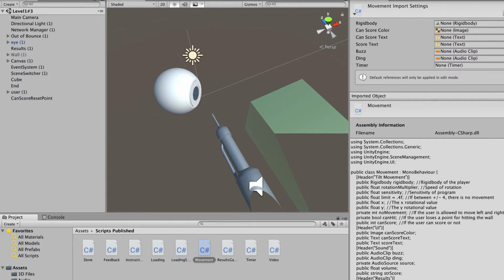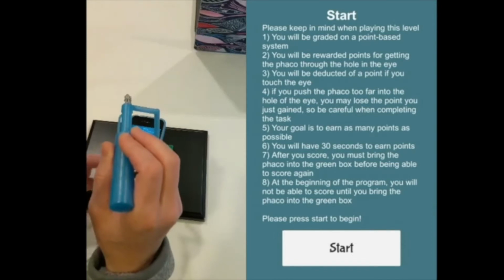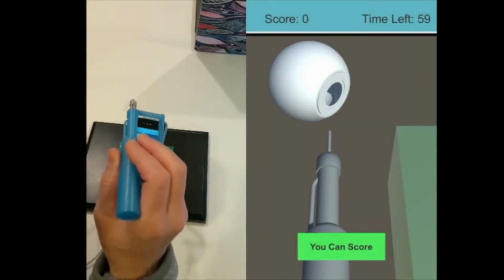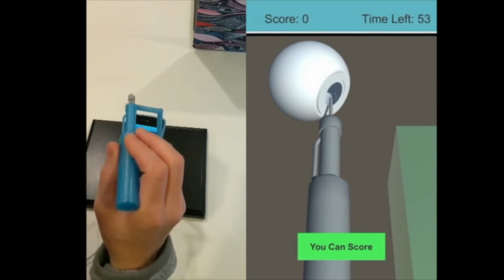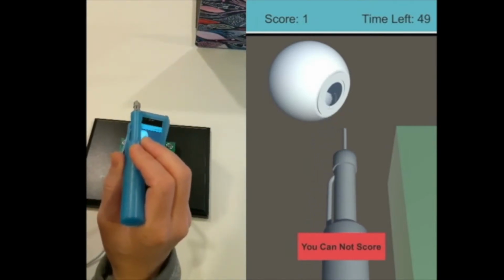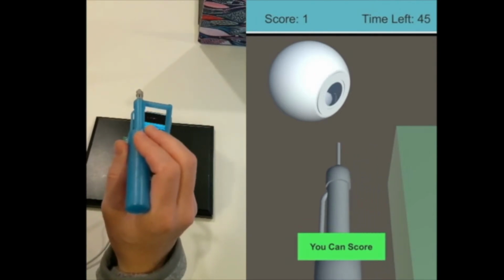for the first task. It is difficult to define what skills distinguish the performance of the surgeons from the non-surgeons in the simulator. Some of the distinction is probably fine motor skills, but some of the difference seems to be a learned caution. To the extent that practice on the simulator improves these skills, it may prove a valuable tool for training residents in countries in which they do not have access to expensive full-featured simulators.